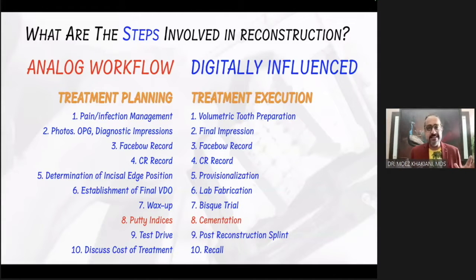Not possible yet. But remember, we're in the age of advancements. Maybe in the future, we could go 100% digital. At this point of time, we're going to mix analog and digital protocols together so that we can achieve a predictable end result and one which is in our patient's best interest.